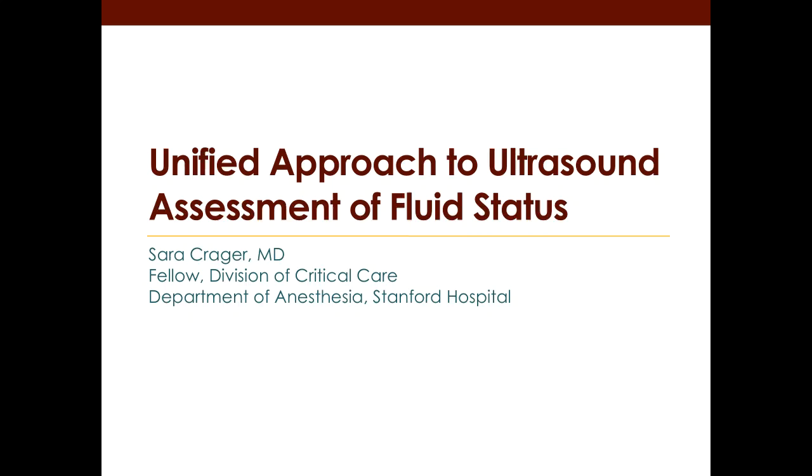Today I'm going to talk to you guys about a unified approach to ultrasound assessment of fluid status. And this lecture is really going to focus on putting together a number of different ultrasounds that you guys already know how to do from previous lectures in this course, and focus on the big picture approach. Because for fluid management, knowing how to technically do the ultrasounds is just not enough. You need to know what they mean, what they don't mean, and how to use ultrasound to help you put the full picture together.